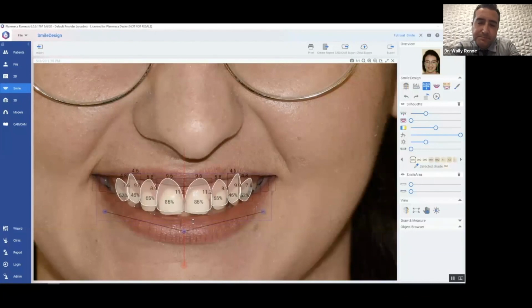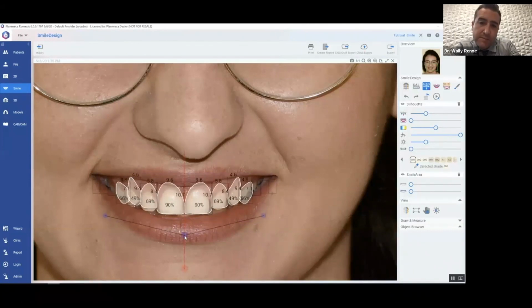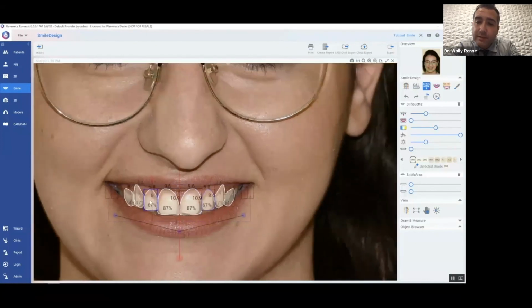Okay, very minor. And so what I'm able to do with the software with these tooth silhouettes is I'm able to move them all at the same time and keep the dimensions that I want, or I could distort the silhouettes individually and mirror image them. There's a lot that you could do with these silhouettes. So right now, I'm just trying to get them to fit the smile arc by altering the size of all of them at once. And once I have them relatively close, I am now going to probably start to do individual manipulations of the teeth.